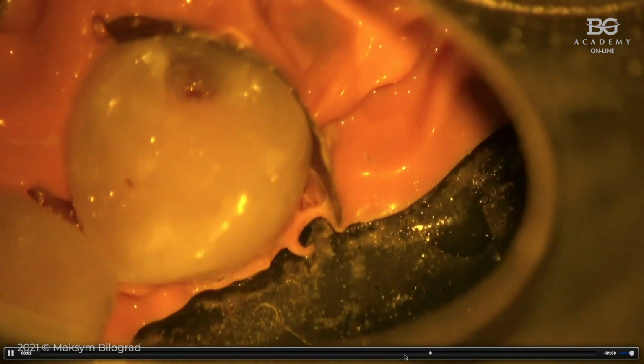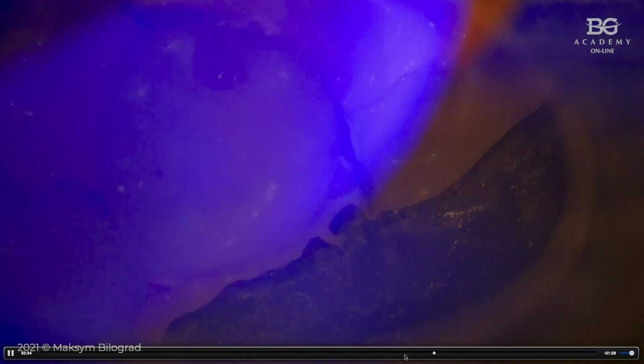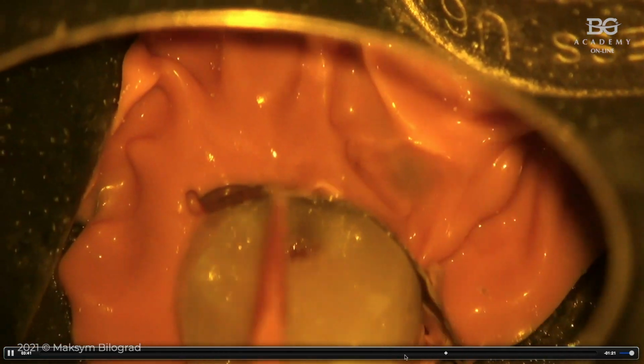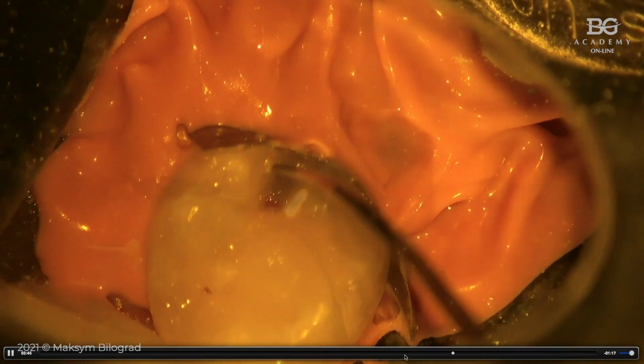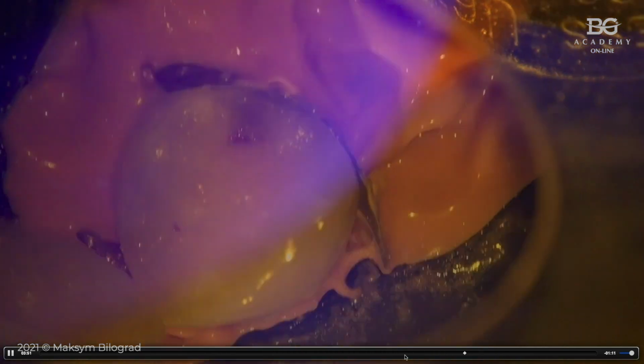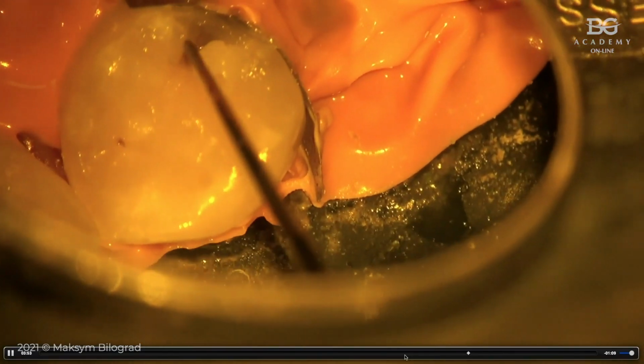I can do a proper layering technique and create these 3D effects without any tints. But anyways, I tried my best in all techniques at that time. You can even see that I put tint in the dentine layer. Then I used a very thin enamel layer to make these crazy fissures, secondary fissures or whatever.